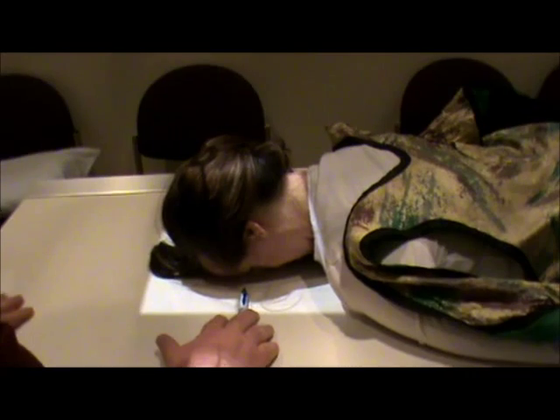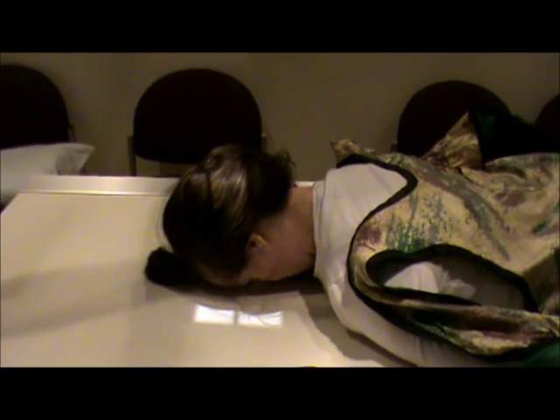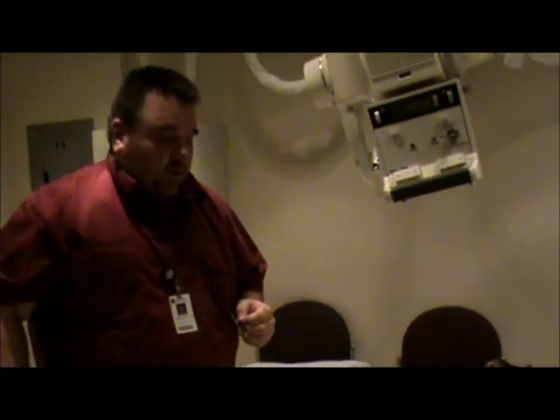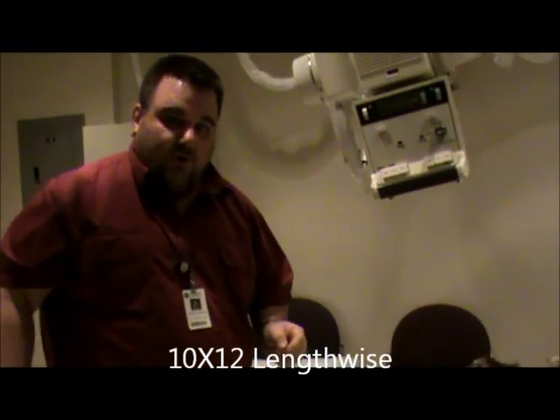The ray is entering at the level of the nasion, which is indicated by my pen. I'm going to move the pen out of the way. As far as collimation, we're going to collimate just to the skin margins, but it's going to be a tighter collimation, just to the level of the orbits. I'm going to put my left marker here, just in it without obstructing. The technique is going to be 77 kV, center cell. We used a 10 by 12, and it's lengthwise. The petrous ridges on this view should be in the lower one-third of the orbits. This is our Caldwell view.